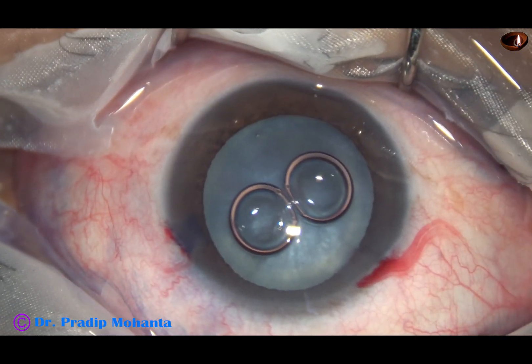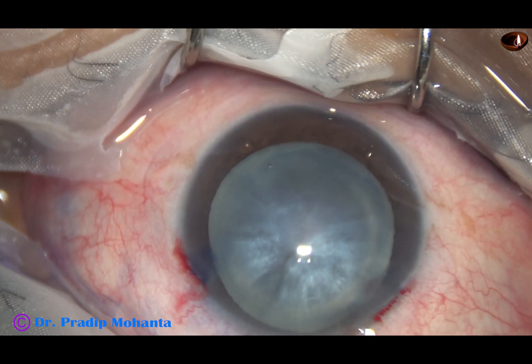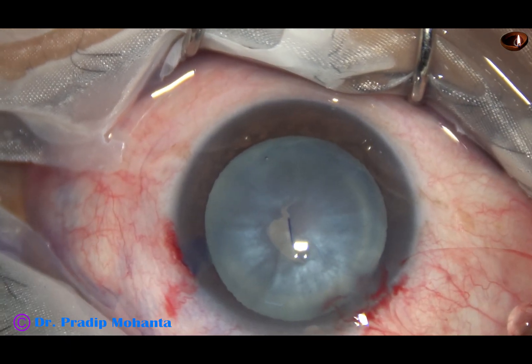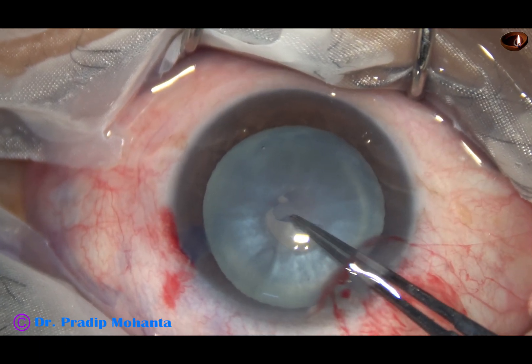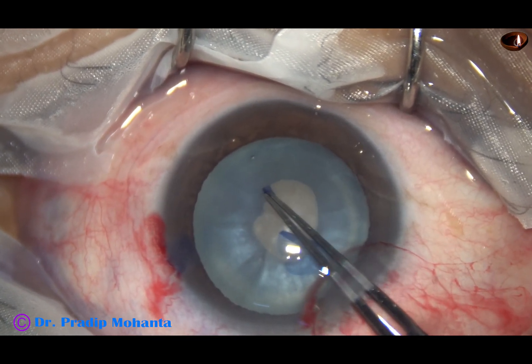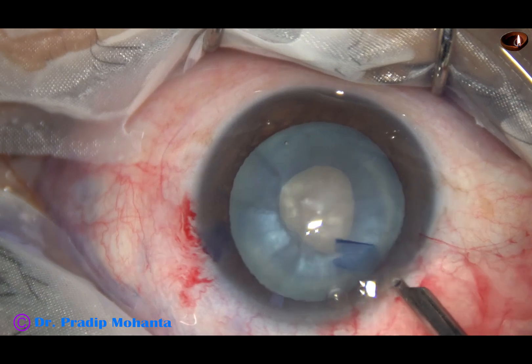By this time, in this case, we have made two incisions. We have stained the capsule with trypan blue dye, and now the anterior chamber is filled up with 2% hydroxypropylmethylcellulose. Using a sharp needle, we do a C-flap at the center of the anterior capsule, and then this C-flap is guided to complete a small CCC — continuous curvilinear capsulorexis.